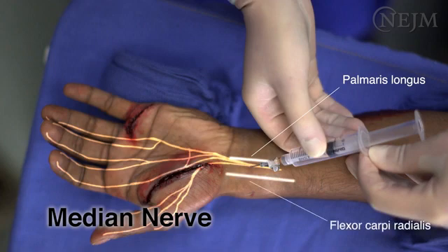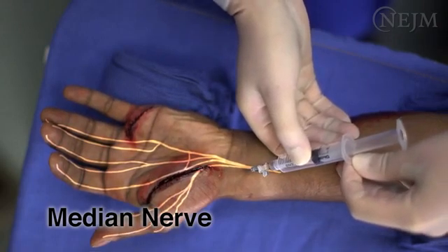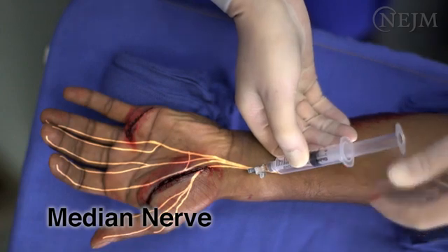The palmaris longus tendon may not be present in all patients. If absent, the nerve can usually be found on the ulnar side of the flexor carpi radialis. The needle should be advanced until it pierces the fascia, which usually occurs between 3 mm and 5 mm of the advance. It is not uncommon to feel a click or a pop as the needle pierces the fascia. Inject another 3 to 5 cc's of local anesthetic.